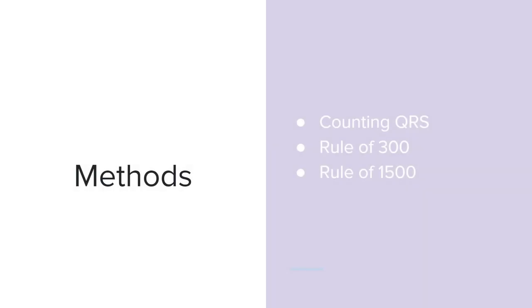There are three methods to counting on an EKG strip: counting the QRS, the rule of 300, and the rule of 1500.